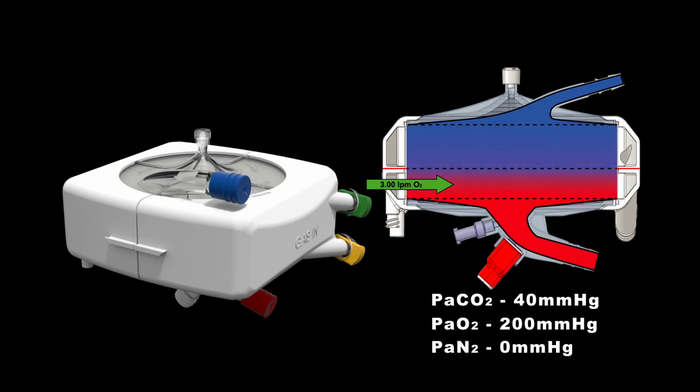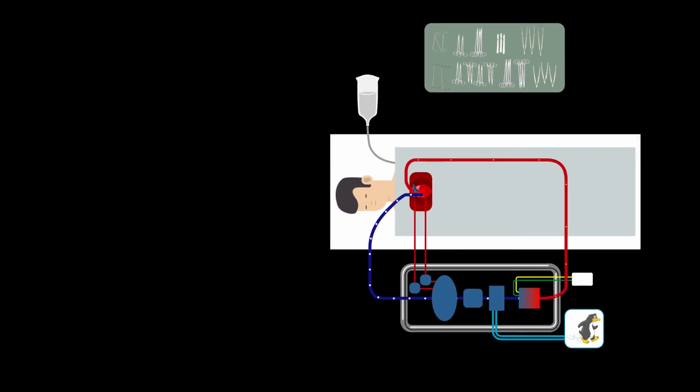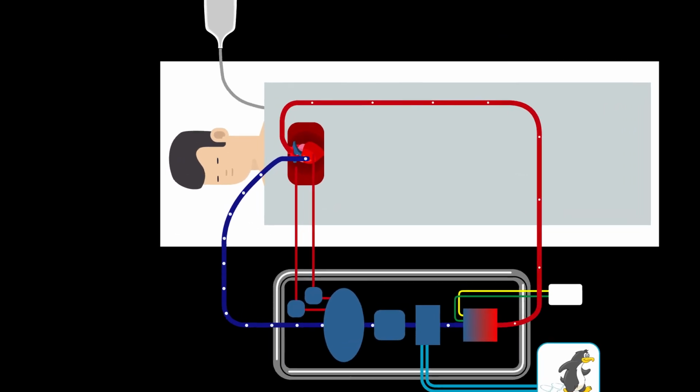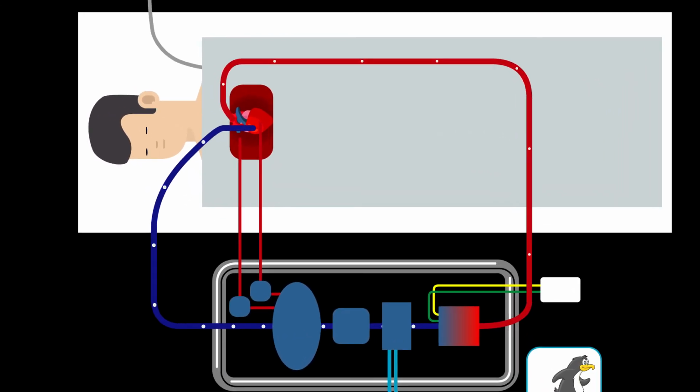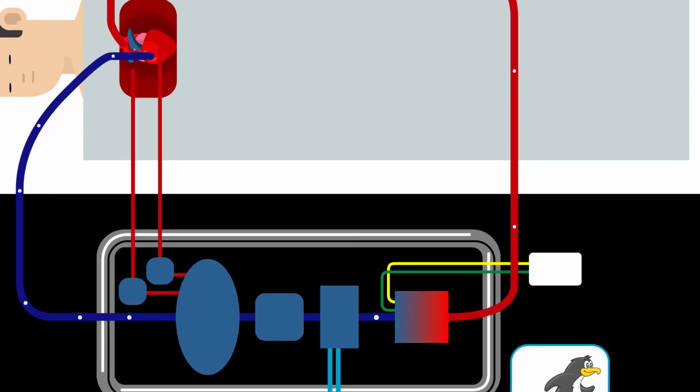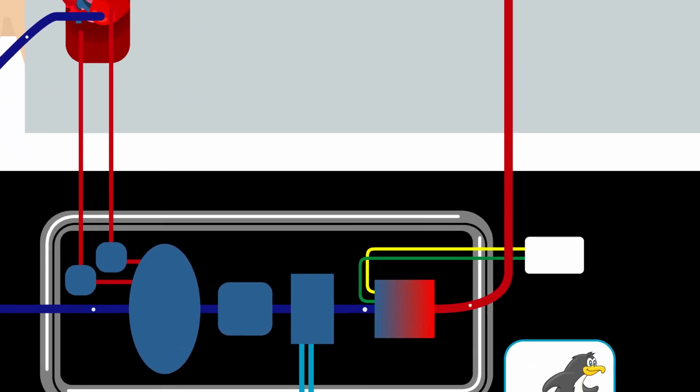By using 100% O2 while limiting PO2, the blood is denitrogenated, decreasing the sum of the partial pressures of dissolved gases. This provides the capacity to dissolve nitrogen bubbles. By eliminating nitrogen from the sweep gas, over time nitrogen moves out of the blood into the gas exhaust and nitrogen is not replaced, we have created the capacity to dissolve additional gas into the blood.